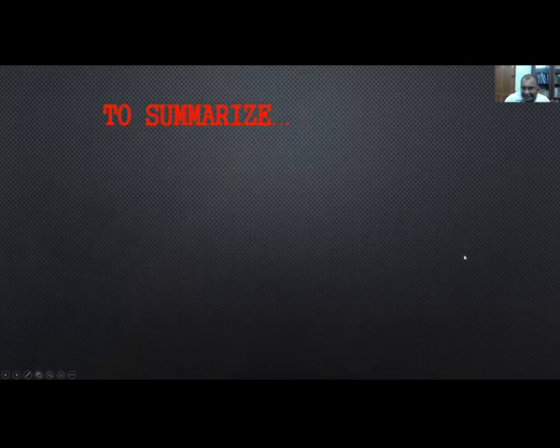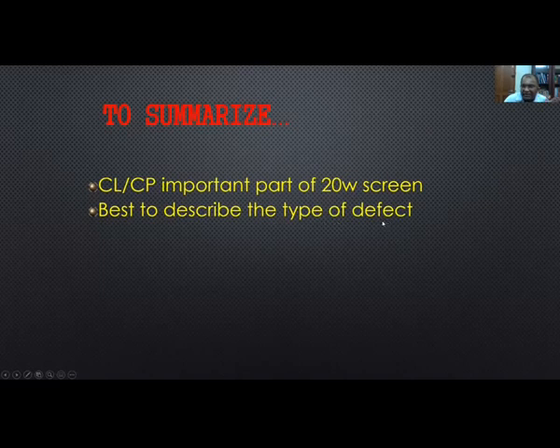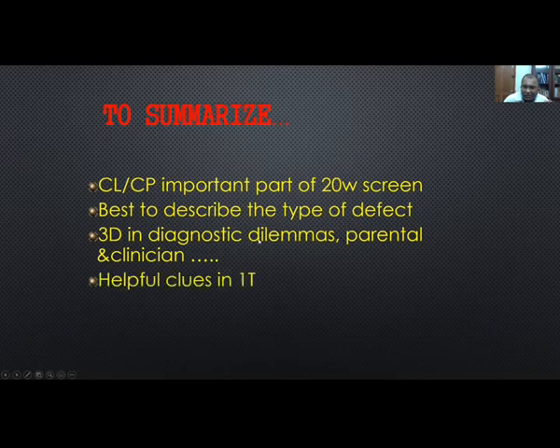So to summarize the facial clefts, they form an important part of the 20-week anatomy scan. And it's best to describe the cleft or describe the defect rather than using type 1, type 2, type 3, because the type you are describing may not be the classification the surgeon may be following. 3D is definitely useful for non-imaging people to convey more information, especially to the parents and the surgeons, and also in diagnostic dilemmas.